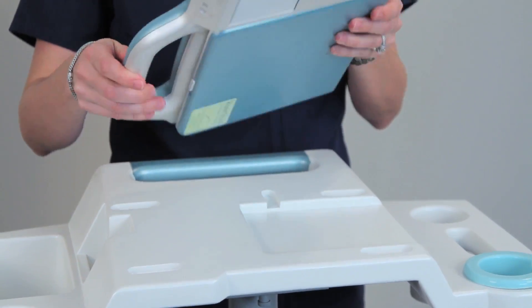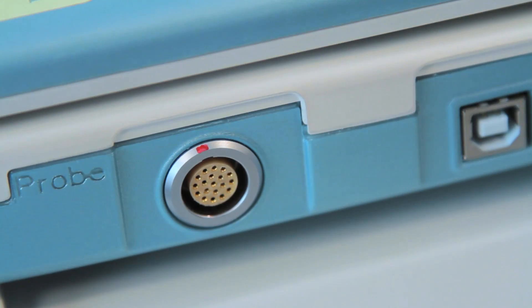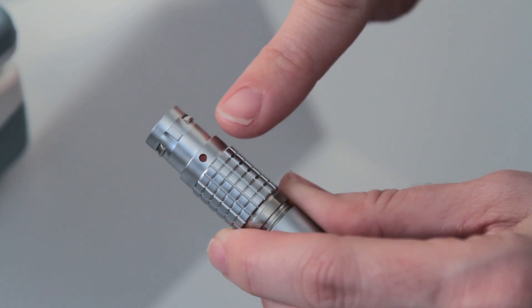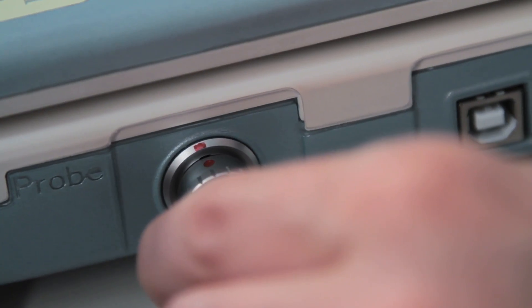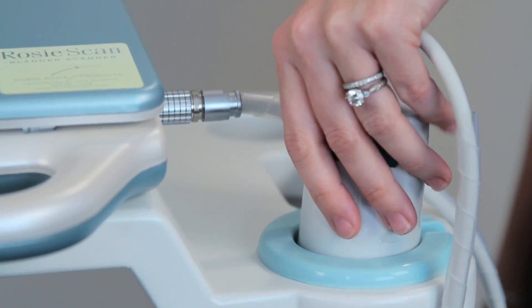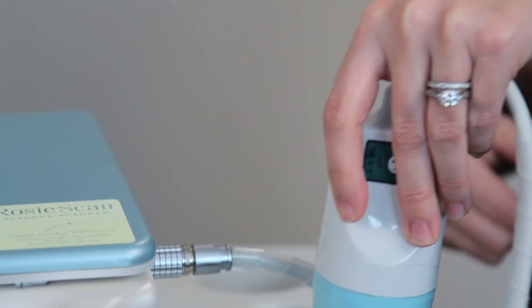Once the battery is secure, flip the unit back over to attach the probe. You will see a red dot on the main unit port and on the plug at the end of the probe cord. Align the two red dots and then plug the probe into the main unit. It is important to not scratch the surface of the probe, as this will result in inaccurate readings.